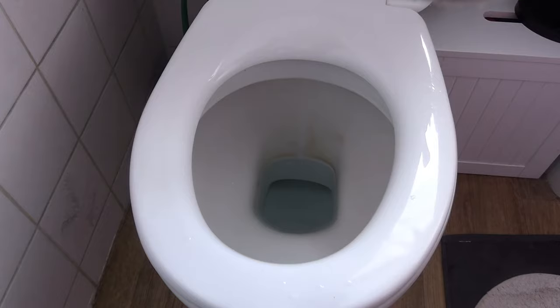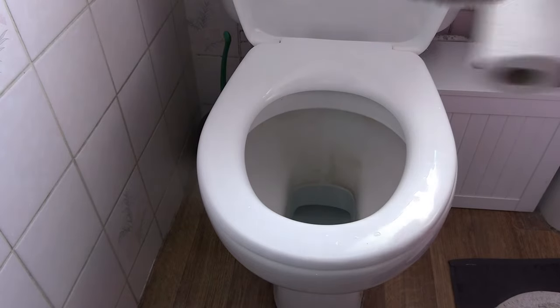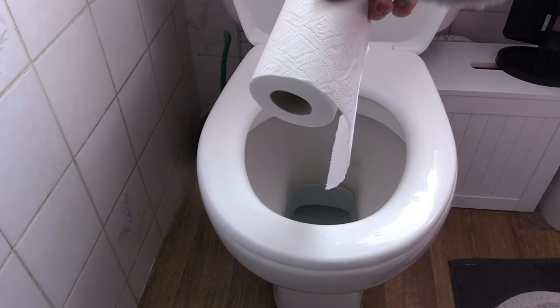I have a simple solution for you, and it's very easy. It involves sticky tape and toilet roll.